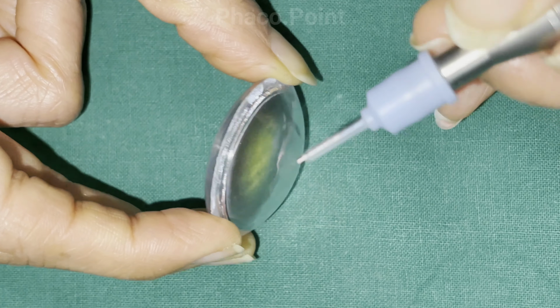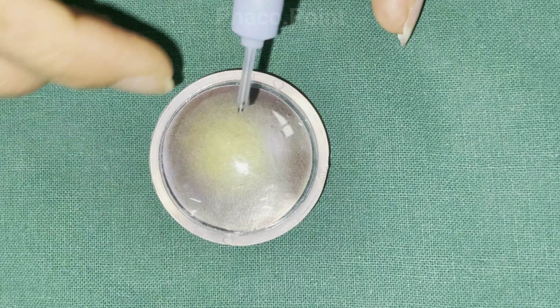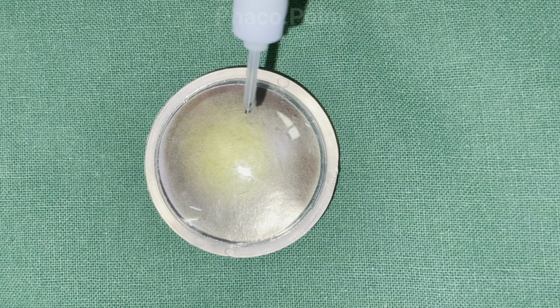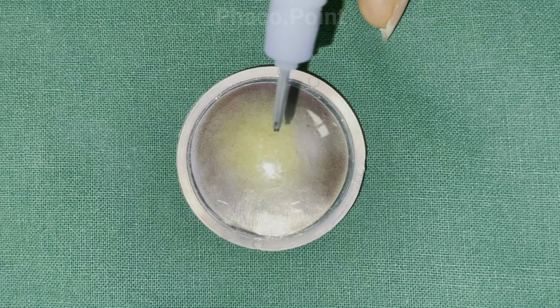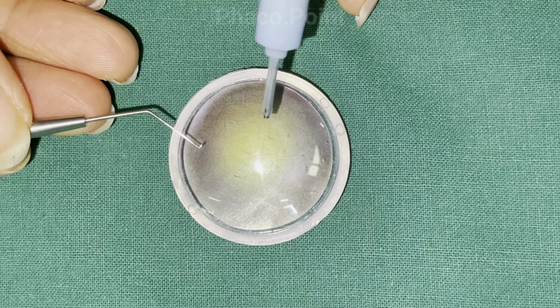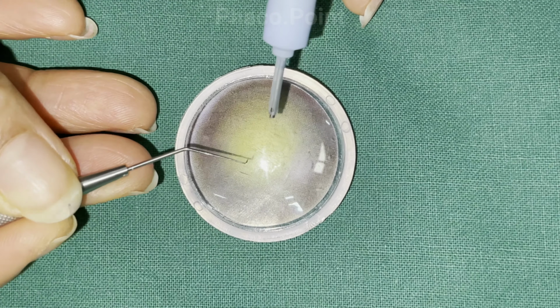So, to recap, you start your chop here, just beyond the proximal rexus, not in the center, but start chopping here. So you enter into the eye with the bevel down position, use both hands, turn the probe into the bevel up position. Your second instrument, which is a chopper of adequate sharpness and adequate length, is now introduced through the second side port incision, and now you're ready to chop.